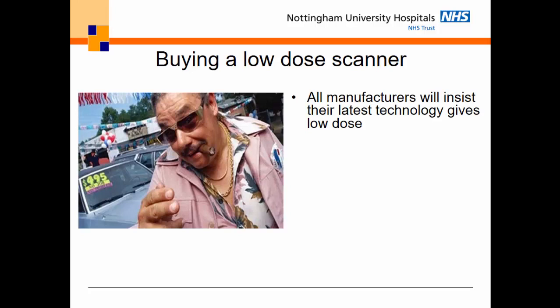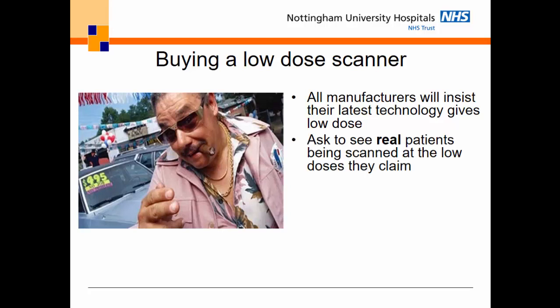That is their motivation. So all manufacturers will insist that their technology gives the lowest dose, because if they were to tell you theirs was the highest dose, you wouldn't buy their scanner, right? So they never tell you theirs is the worst. You should ask when you go on a site visit to see real patients being scanned at the doses that they claim. Anybody can show you lovely images on a workstation.